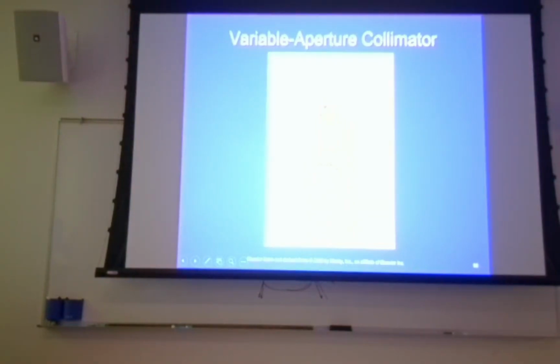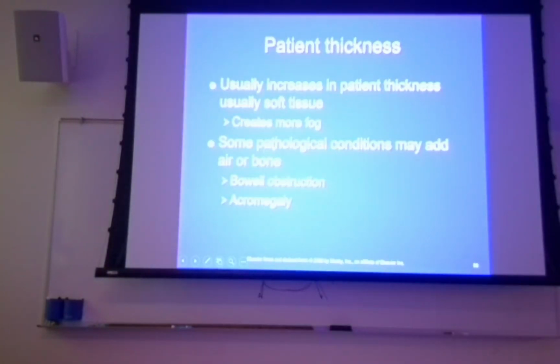So that's your setup. These are the shutters you're familiar with. The multi-leaf is up here. Off-focus radiation is reflected by this little ding right there on the nut that's holding the anode onto the anode stem. And that is not to scale. So we've kind of done this to death.